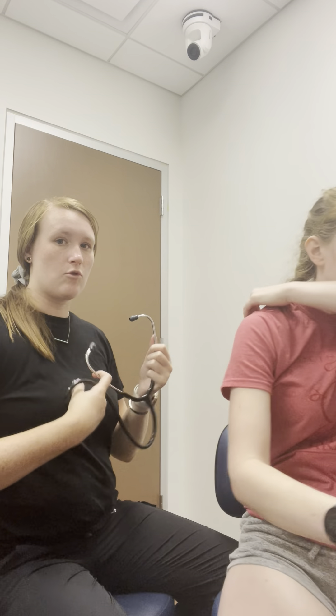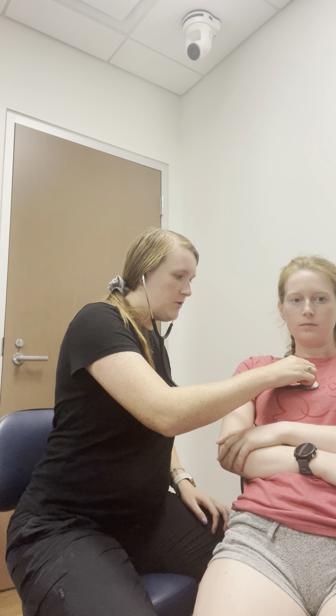And again, you're listening for anything abnormal — either too quickly, not enough, any sort of murmur, any sort of abnormality besides a normal rhythm. For the heart, we're gonna hit four points, and I just want her to be normal.